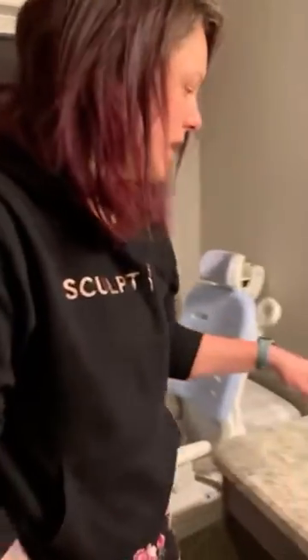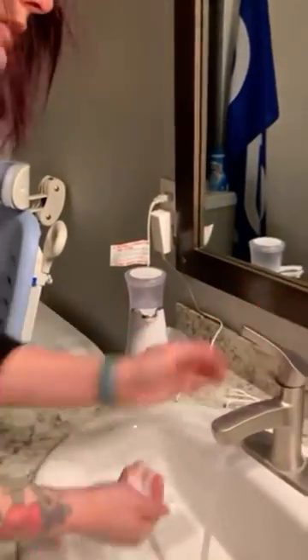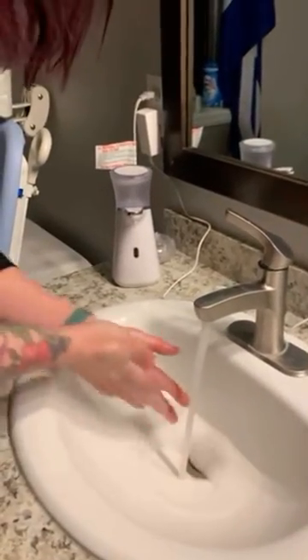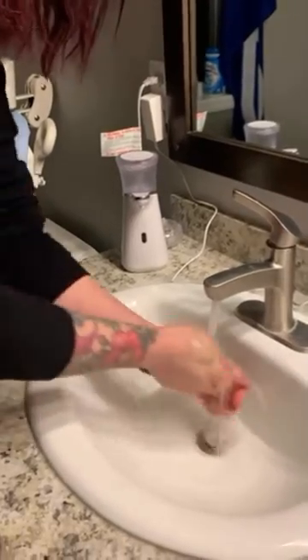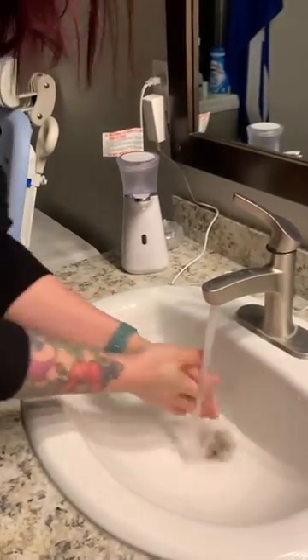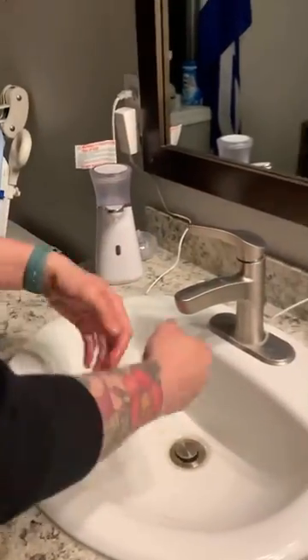G-tube cleaning. This has to happen once a day. First of all, always make sure that your hands are clean. Wash with hot water. Wash good. Shut the tap off with your arm.